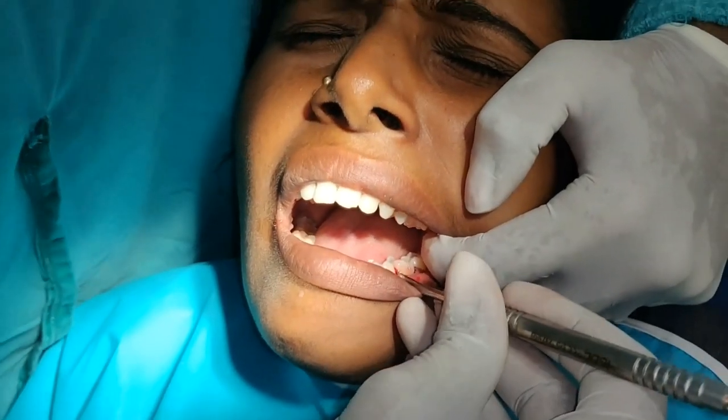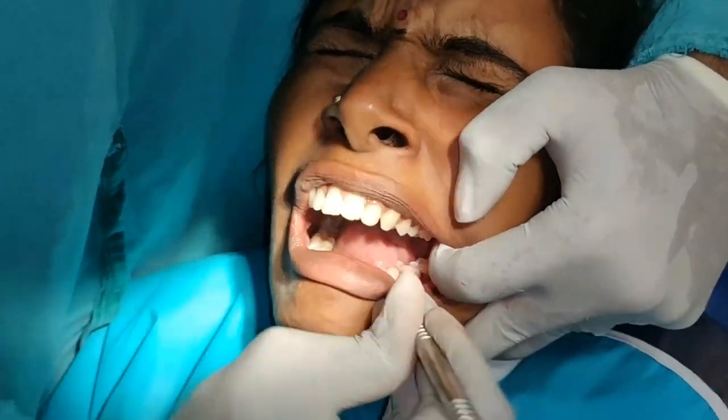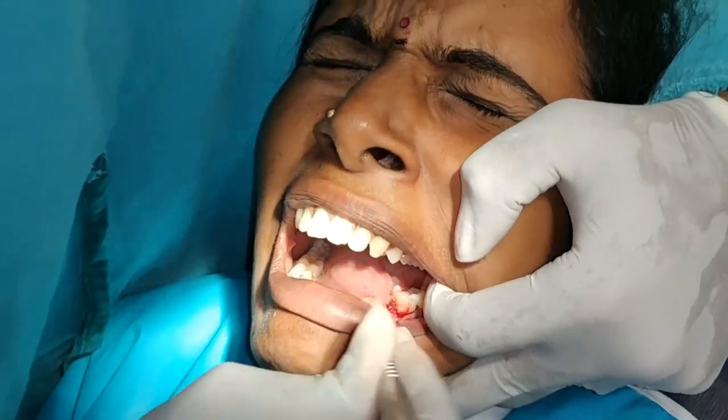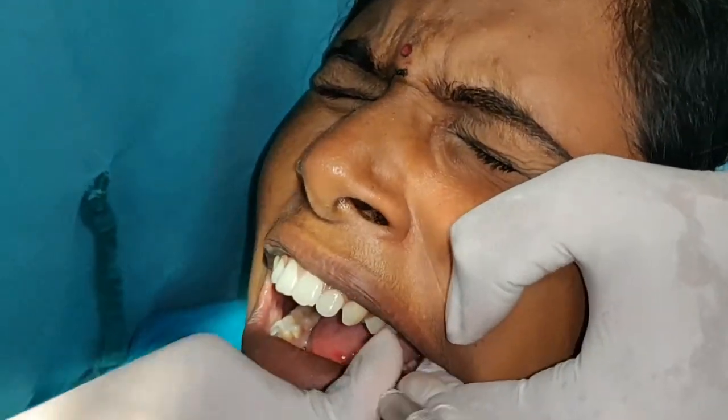Here I am using a periosteal elevator, trying to wedge between teeth 35 and 36 in order to luxate tooth number 36.